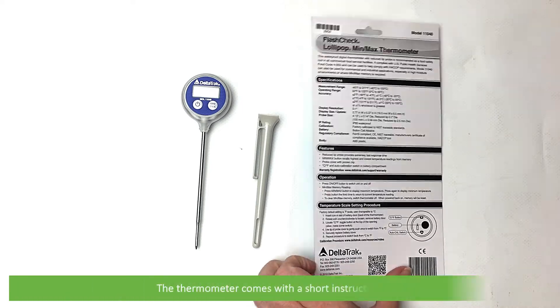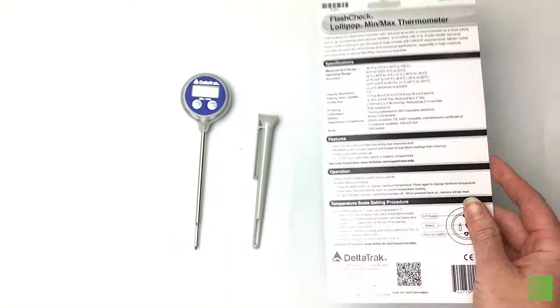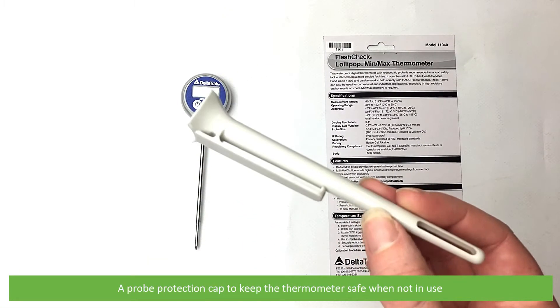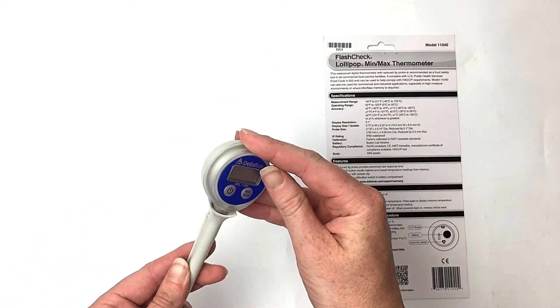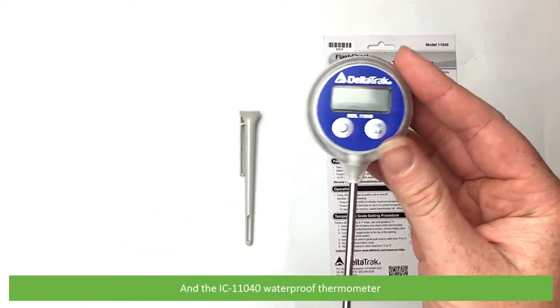The thermometer comes with a short instruction card, a probe protection cap to keep the thermometer safe when not in use, and the IC-11040 waterproof thermometer.